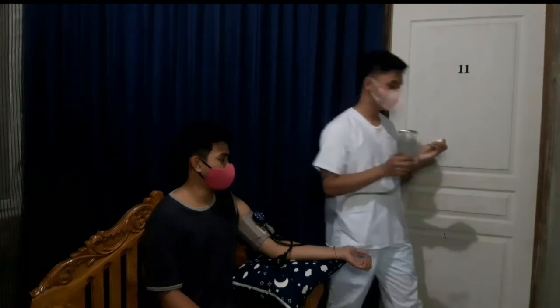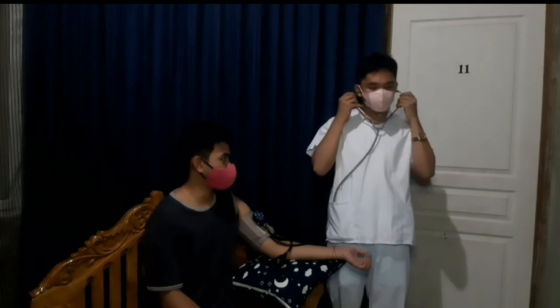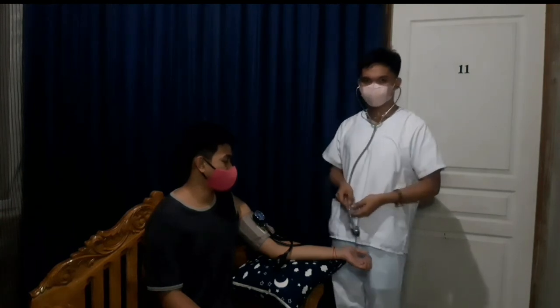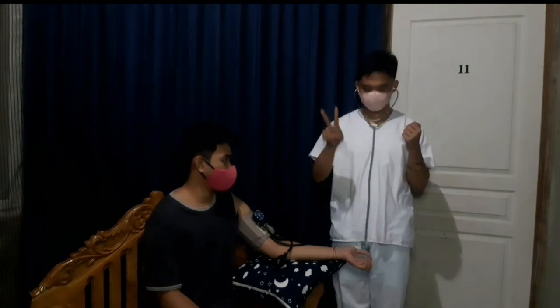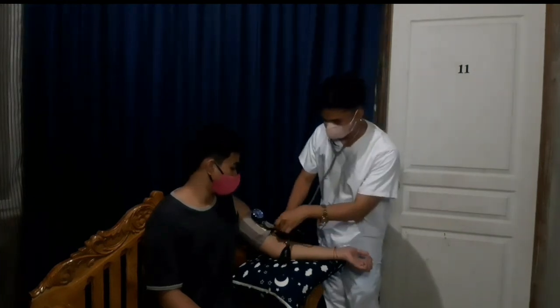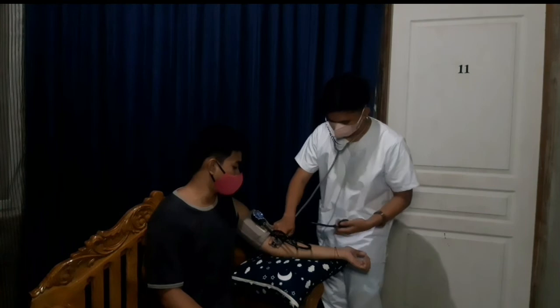Position the stethoscope appropriately and cleanse the earpiece with alcohol or recommended disinfectant. Insert the ear attachment of the stethoscope in your ears so that they tilt slightly forward. Ensure that the stethoscope hangs freely from the ears to the diaphragm. Place the bell side of the amplifier of the stethoscope over the brachial pulse. Hold the diaphragm with the thumb and index finger.